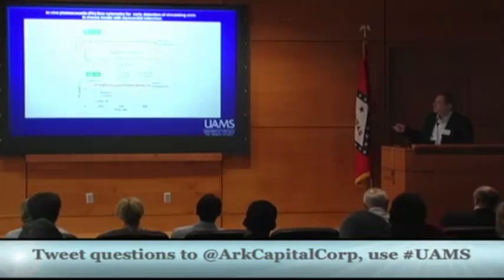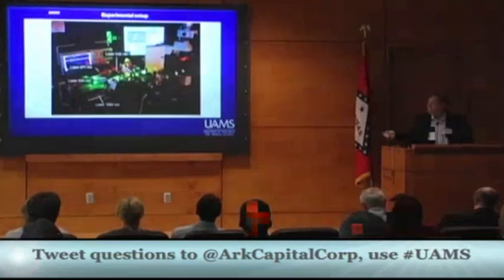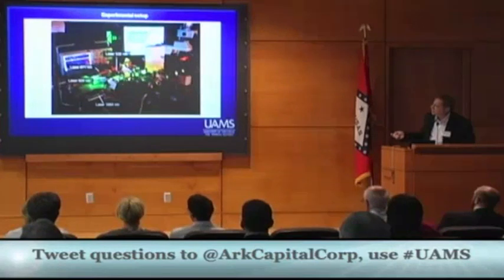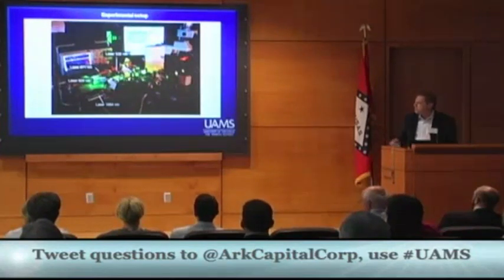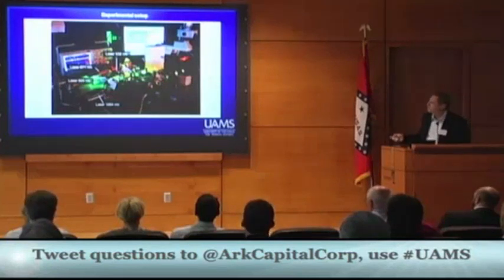Of course, I'm talking about just one application, stroke. It's related with some heart attack, thrombosis, with a nose problem, lung problem, etc. But it's more dangerous. That's my idea. It's very simple where we are. This is an experimental prototype, several lasers. It's not portable. Several lasers which irradiate blood vessels in different animal models with different wavelengths, just select signals.